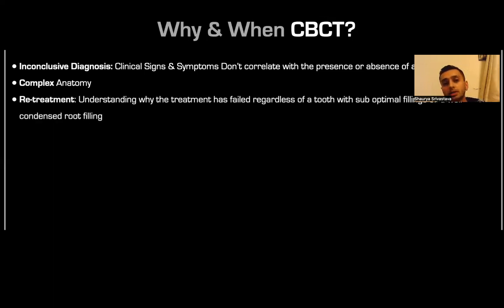Retreatment. I personally take a CBCT for all my retreatment cases, because I like understanding why it has failed. Regardless of a lesion or no lesion, you can have missed canals or suboptimal root fillings. You know why it potentially would have failed, but a CBCT will make you understand more so why it has actually failed, because a failure in endo can be multifactorial. So for retreatment, every case that I do, I would be taking a CBCT, because I do not believe in walking in on surprises.